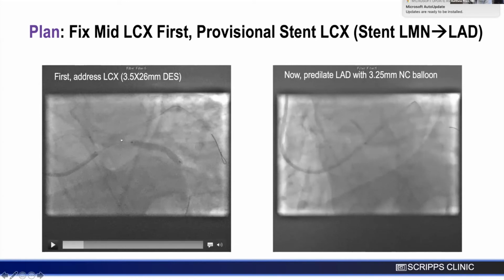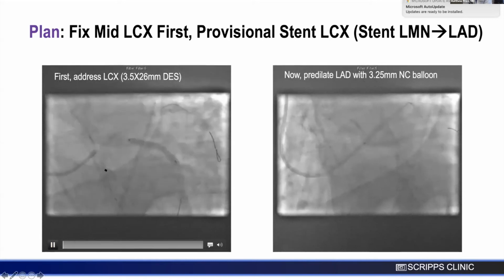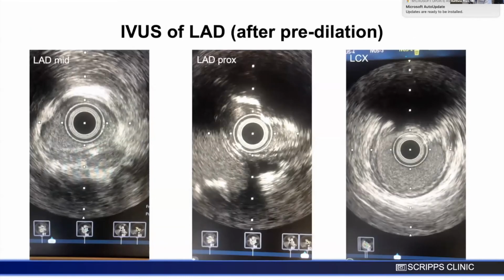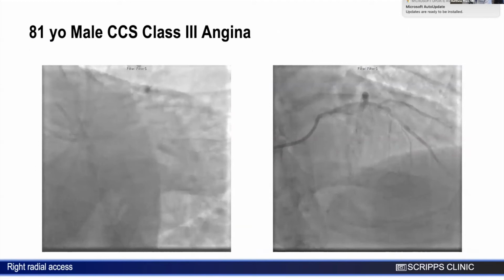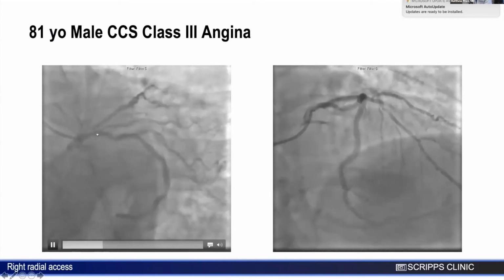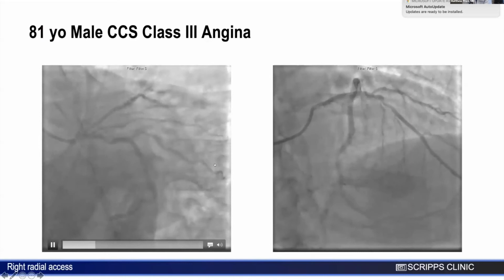I didn't. It's hard to see, but the ostial circ is way back here. I use IVUS to document exactly where I had to stent from where to where. So I landed in normal tissue. Don't worry, I'll go back just to prove myself. Okay. So you can see that the circ goes right to about, I want to stent right back to that, just past that little OM there. Make sense? Tamir? Yep. All right.